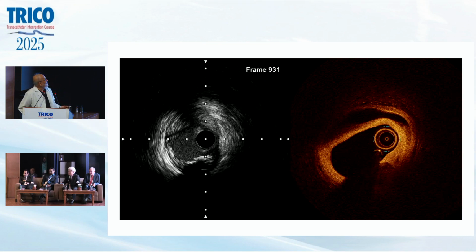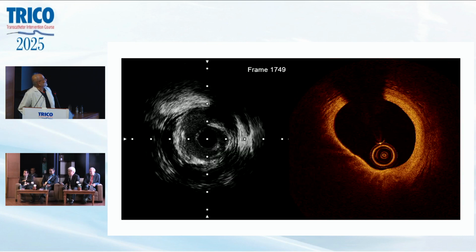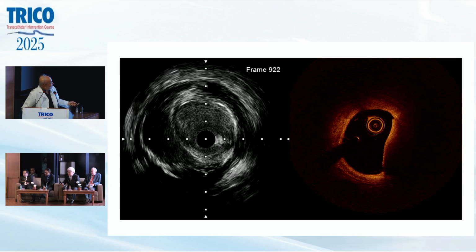What will you do with this? And what will you do with this? This is again big hematoma, right? Here it is hematoma, or lipid. See, that is what I am coming to the point, Ajay. The OCT does not see very distant things, and many times this type of hematoma and dissection you may misinterpret as this. The same here. Let's see. You feel in first impression that it could be TCFA or what, but this is hematoma.